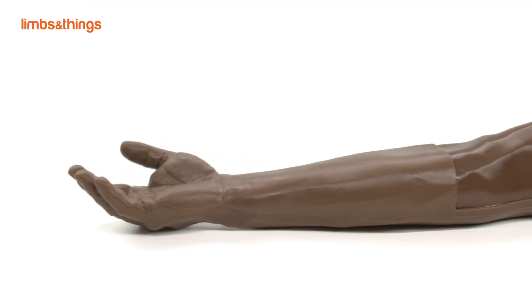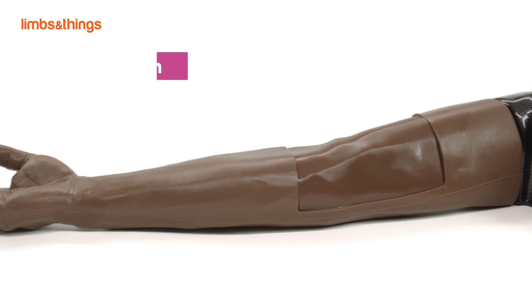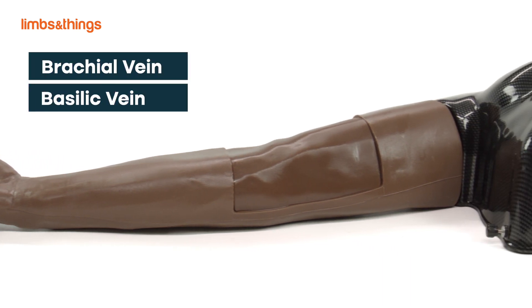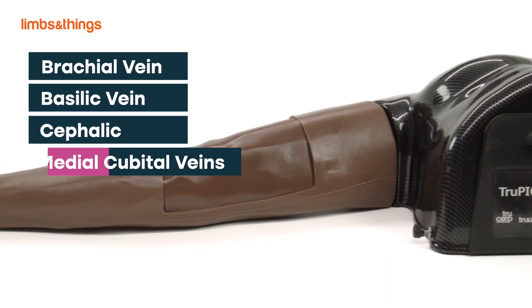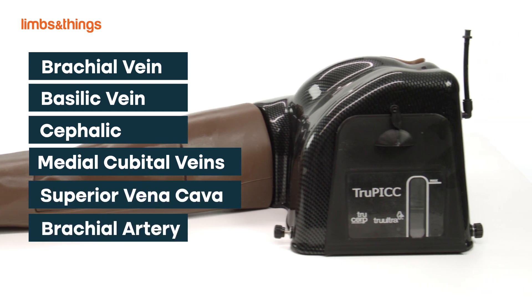The upper arm anatomy features correct and realistic vascular anatomy, including the brachial, basilic, cephalic, and medial cubital veins, the superior vena cava, and the brachial artery for lifelike training.